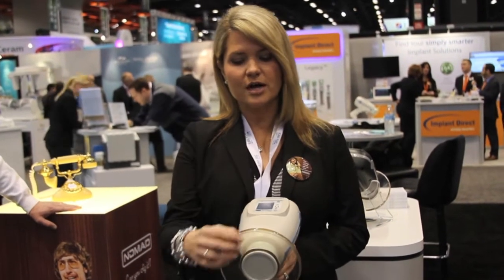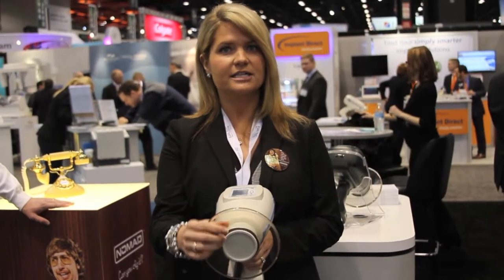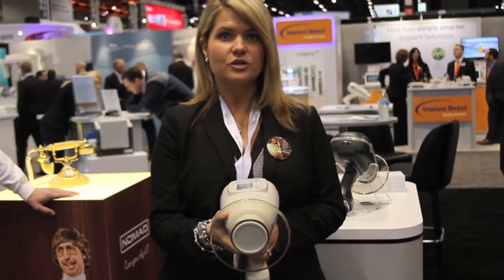It's very important to note that this is actually like an assistant or a hygienist's lead vest. This is actually a shield that protects them from any type of backscatter, so they're protected through the whole time the x-ray is being taken.